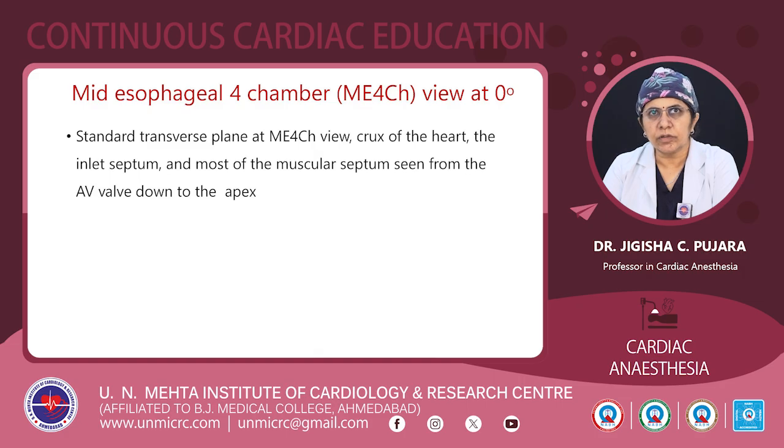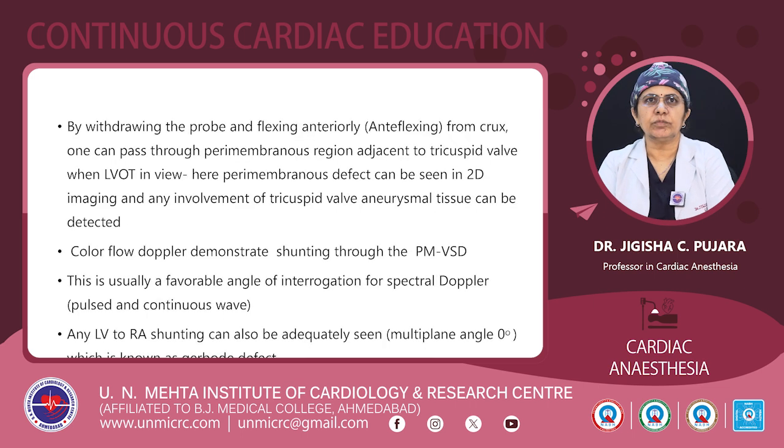Coming to the mid-esophageal four-chamber view at 0 degree, the standard transverse plane, you see the crux of the heart, the inlet septum, and most of the muscular septum from the AV valve down to the apex. So it is a very important view.